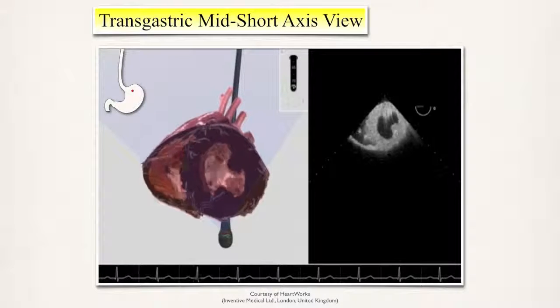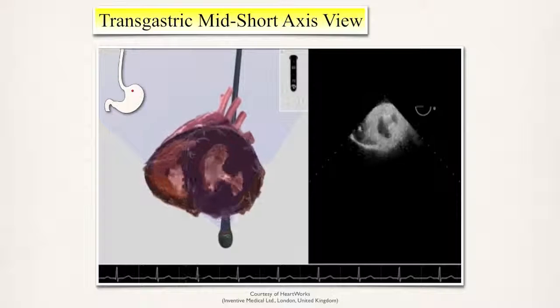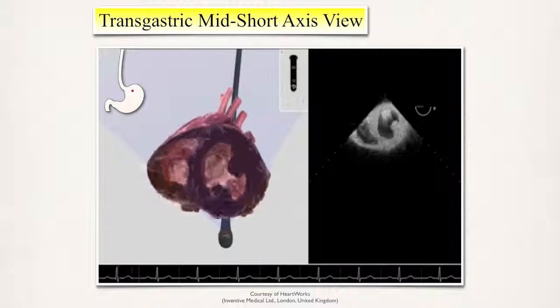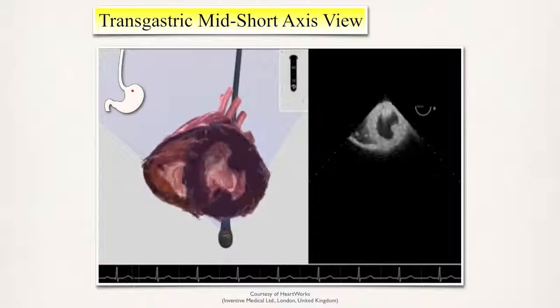Codominance of the right ventricle would suggest significant dilation and require further assessment for pulmonary hypertension, a septal defect, stenotic pulmonary valve, or congenital anomalies. Because of its irregular shape, the right ventricle is only defined in terms of the septal and free walls.